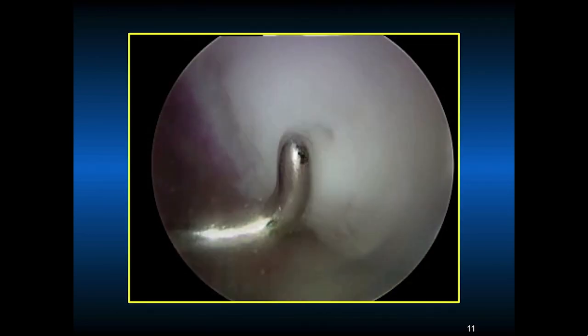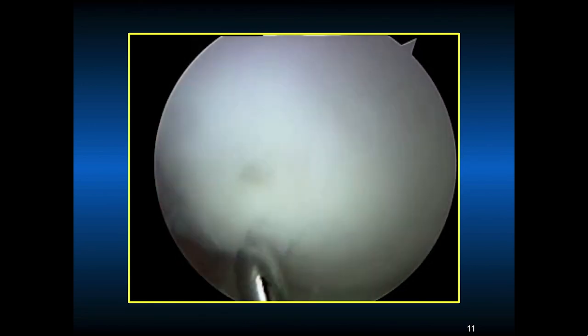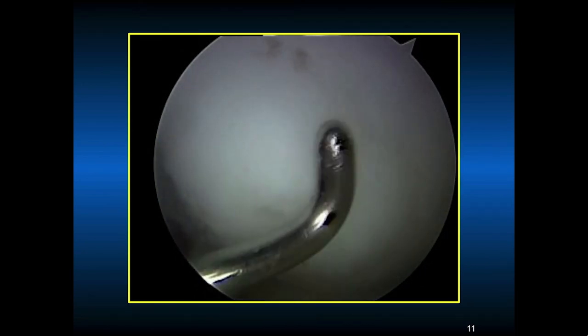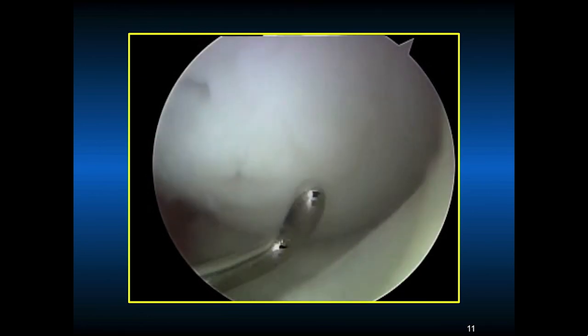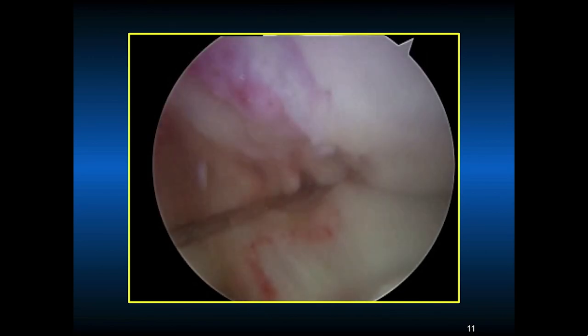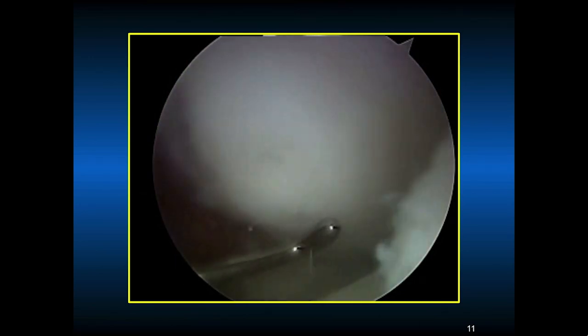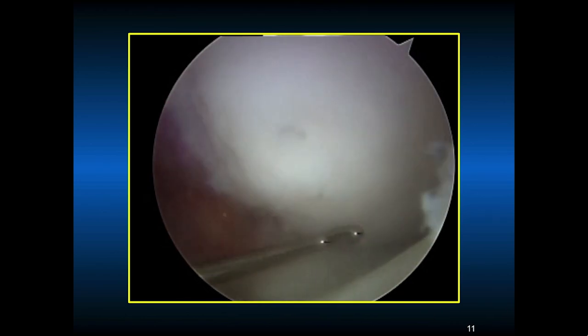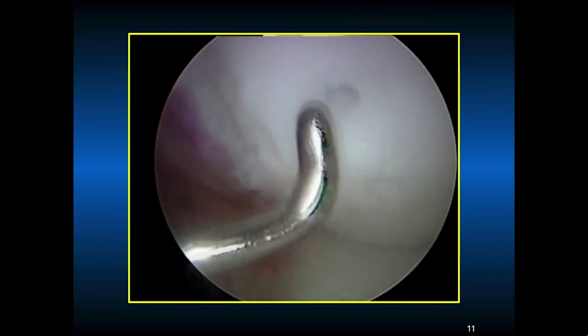This shows us probing the stable OCD lesion that has now been fixed with three smart nails. You can see where the tips of the nails are. The probe does go into the bed of the lesion, but you can see that the lesion is quite stable. You need to make sure the tip of the smart nail is deep into the cartilage so it's not prominent, because a prominent nail tip could cause damage to the tibial articular cartilage.